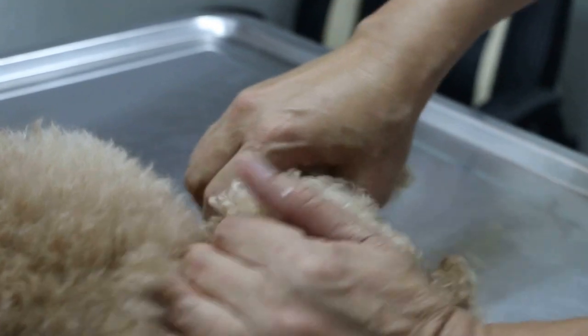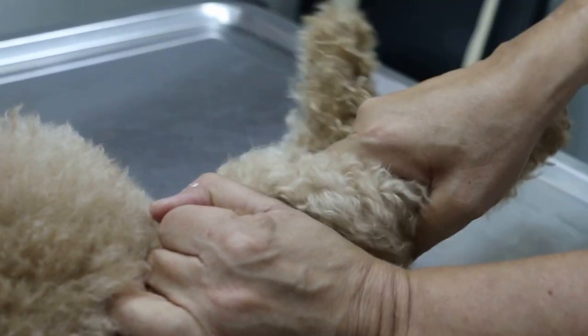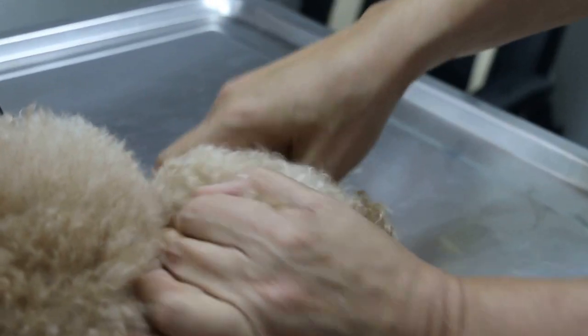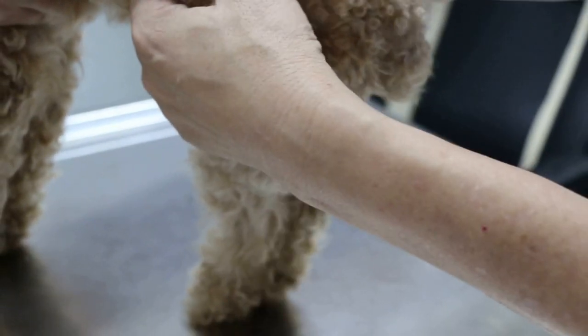Now I check the hip joint. There's no clicking sound. No pain of course. So the diagnosis based on x-ray is subluxation of the left hip joint. That's why the dog wouldn't stand properly, and this subluxation is painful.